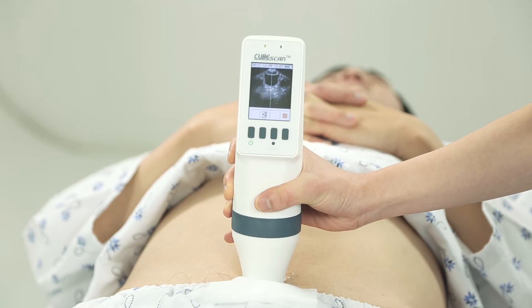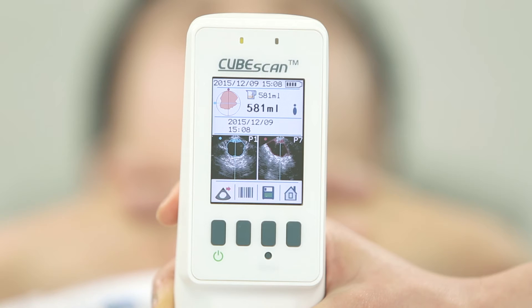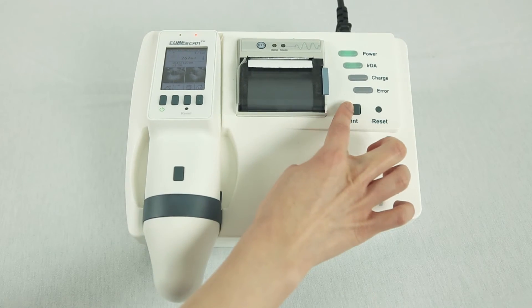If you press the scan button when the bladder is at its largest size, the residual volume will be calculated. Now, you can check the results. You can press the save button to save the results or press the print button on the docking station.